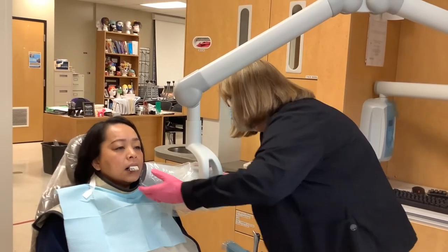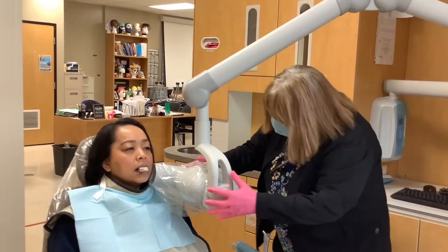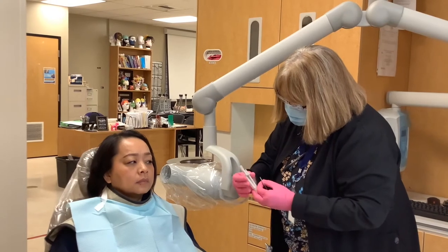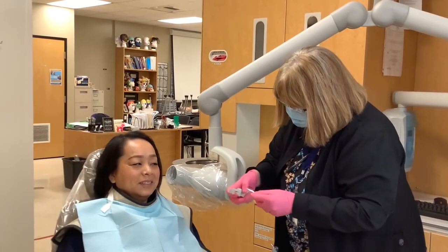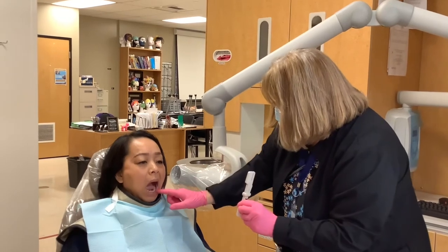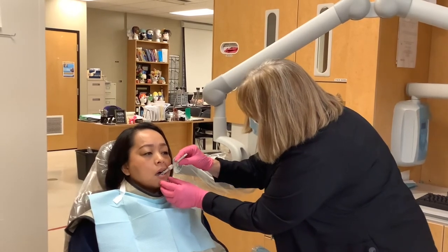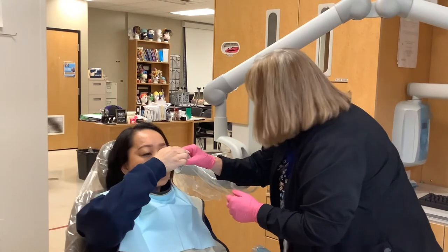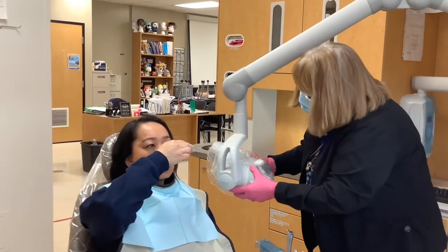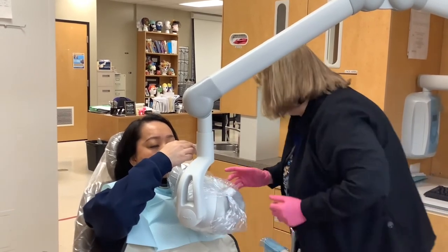There's my film, there's my angle — hit the button, real similar. Now I'm going to my cuspid. This one's tricky on the lowers — patients can get jabbed by the x-ray film. Here's my cuspid right here — I've got to get it underneath. Going right down softly. I have my patient hold it towards the ceiling. Now I'm going to go to my angulation, line it up with the film, and get my shot.